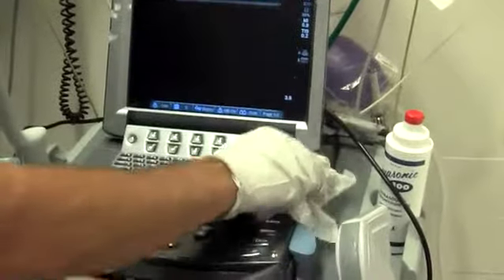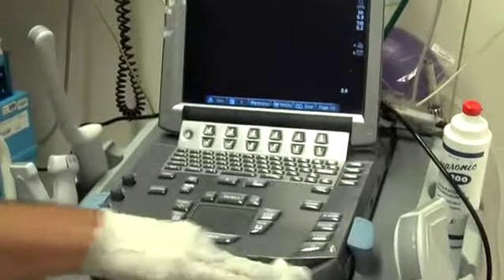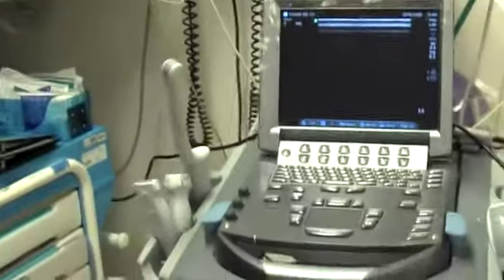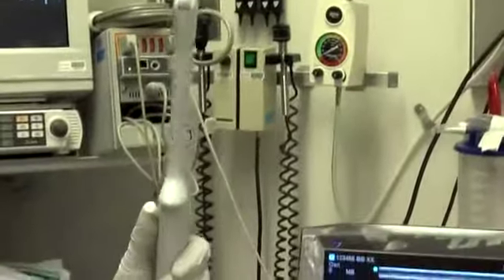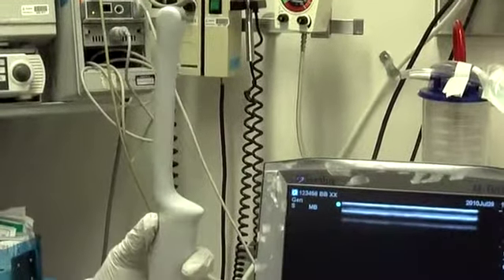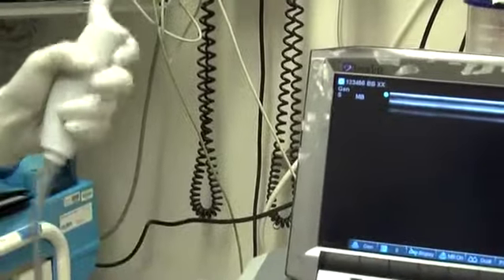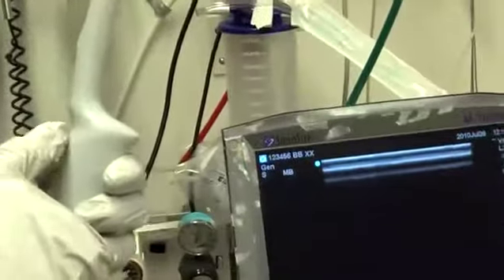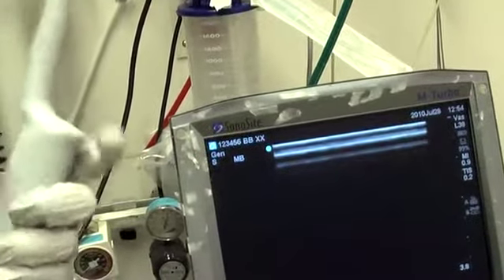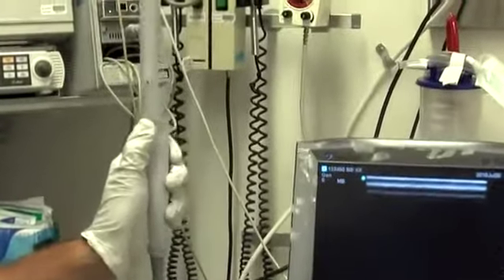So let's talk about the probes very briefly. There's a number of different probes that we have. The endocavitary probe that you're going to be using for your endovaginals or your peritonsillar abscesses. Where's the indicator on that probe? The indicator is basically where your thumb goes. You have the trigger, and then you have the top thumb rest. Good. And this is the probe marker. Excellent. There's also a little nubbin here on the top.